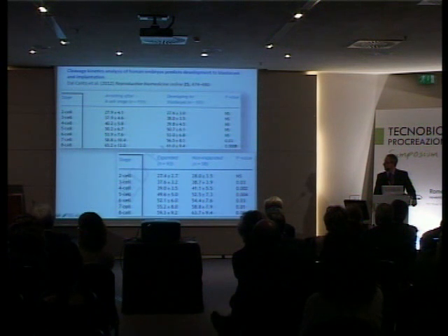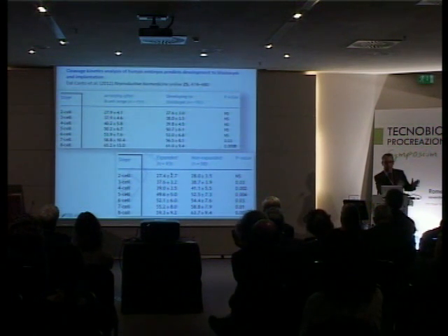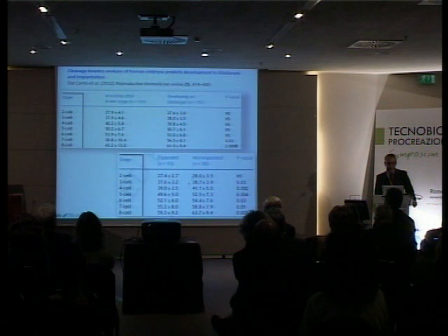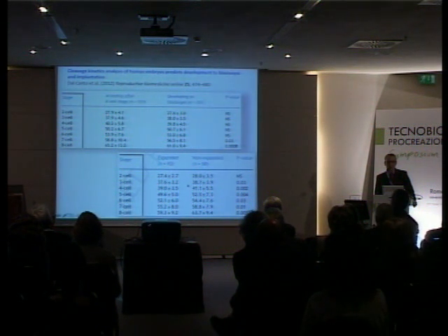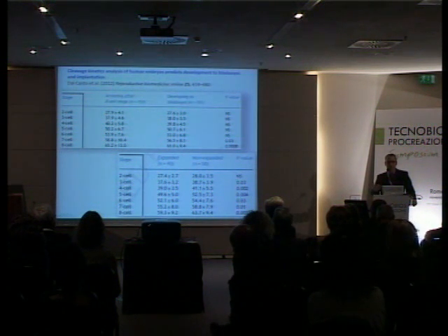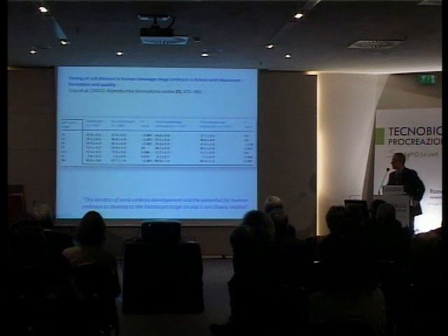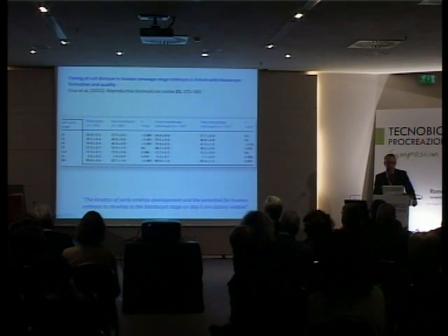And from the 7th cell stage on, we can see, in fact, some differences. So differences are not overt initially. They start to emerge towards the 3rd cycles of division. And in fact, when we compare, according to the same approach, expanded and non-expanded blastocyst, we in fact see a difference. Embryos that are destined to develop into expanded blastocyst at a given time point develop faster. So in a way, we can in fact predict blastocyst development and blastocyst quality.